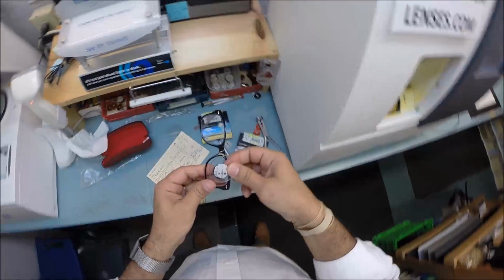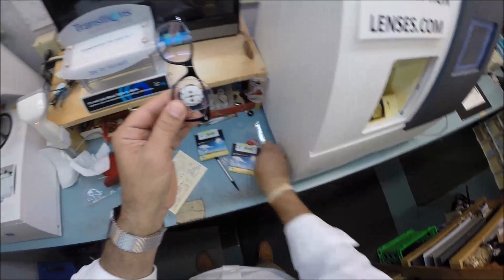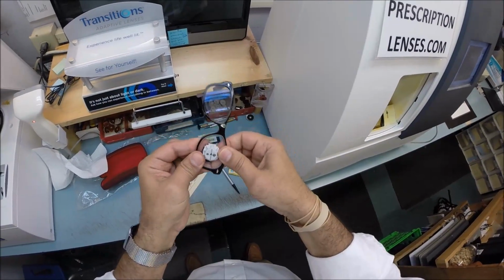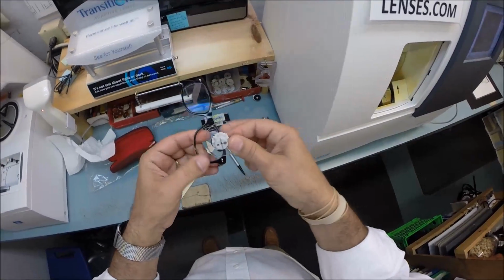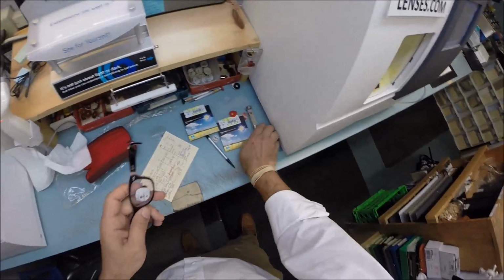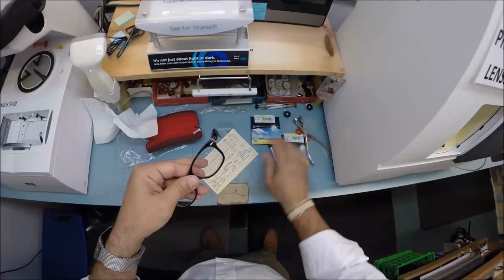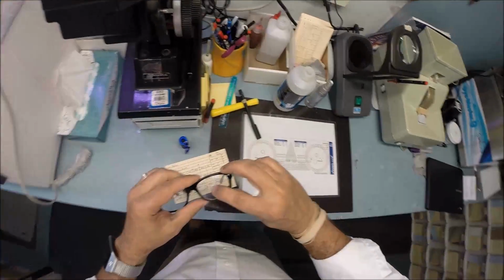So, let's see if it fits. Nope, it just doesn't fit. Something's wrong. Let me see if I can hit it with something. No, okay, again, let me turn it this way. We'll see if it fits this way. It definitely doesn't fit this way. Something's wrong. I need an instruction manual. All right, so I'm going to tuck it into the outside corner using my thumbs, press down at the nose. It pops right in. Speaking of popping, just pop that block off. Pop goes the weasel.